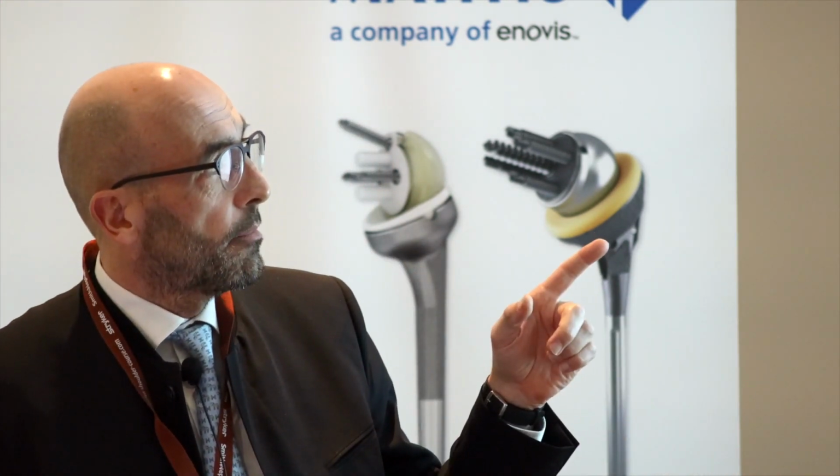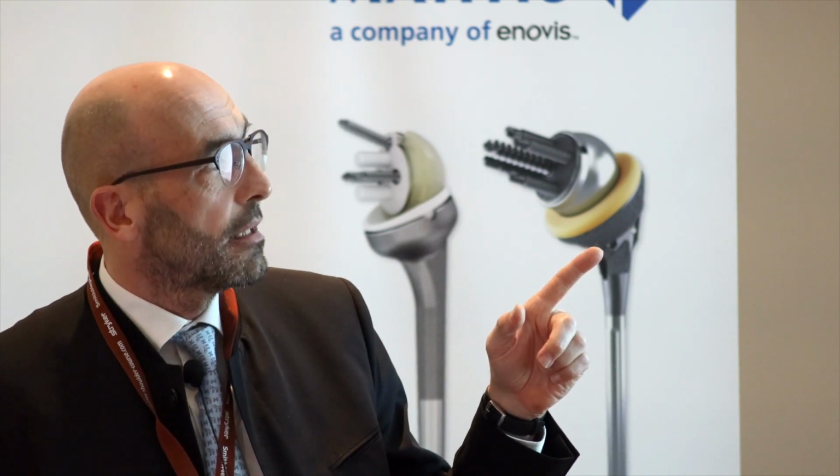of the base plate. And look at this slide. If you compare very good implantation of the base plate to bad implantation of the base plate, you can see the difference between the two groups. So this is the first reason why it failed, because it was not a problem of lateralization or not. It was a problem of the base plate not being well implanted. And if you look as well at the micromotion, there was a lot of micromotion because it was a non-locking screw, and with a locking screw, it was not a problem anymore. So, in other words, now Mark showed us that it was possible to have a constrained prosthesis which works without medializing so much.